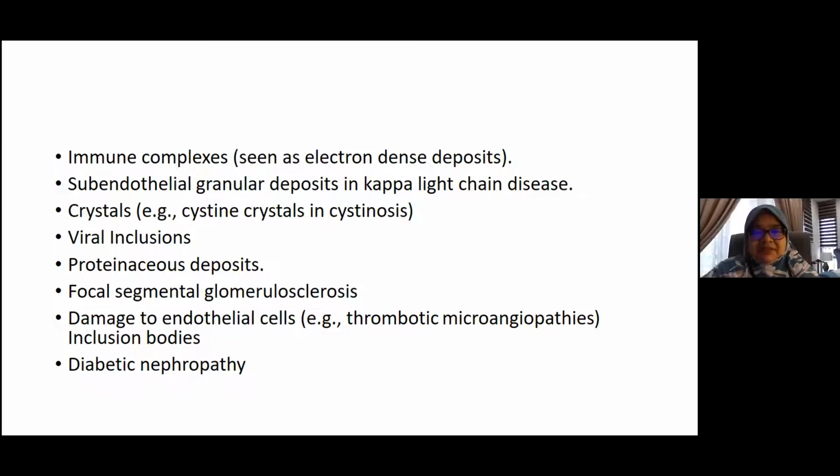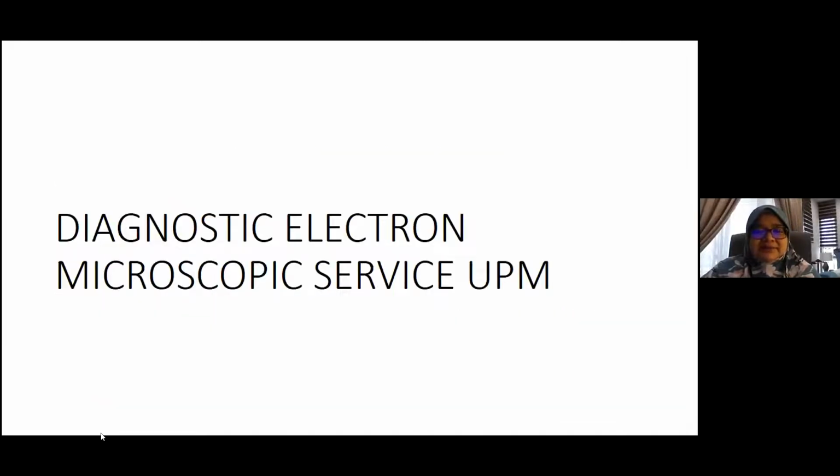We will have confidence in making the diagnosis of IgA by seeing the electron dense deposits in the mesangium and paramesangium. The rest of these conditions are good to have, but we may be able to make a sufficient and confident diagnosis based on our usual panel.